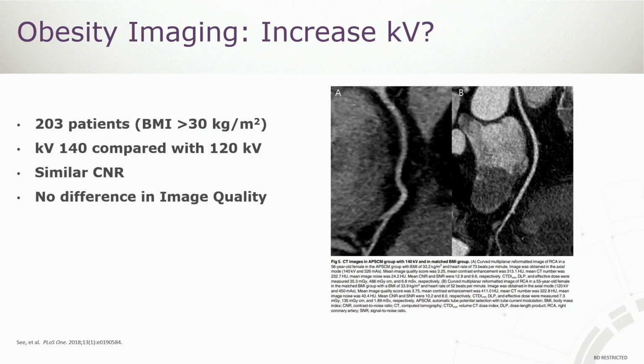So I think another nice aspect of using fenestrated catheters, especially when I've talked about increasing your CNR, really increasing that attenuation in the aorta, is that it's going to help you with larger patients as well. And again, our site's in North Carolina. We've had to look at ways to image larger patients in a more meaningful way. We don't want to preclude anyone from CCTA, and people are not getting any smaller, unfortunately.